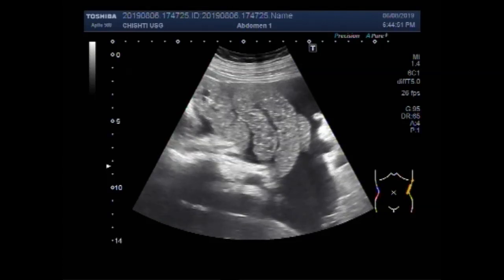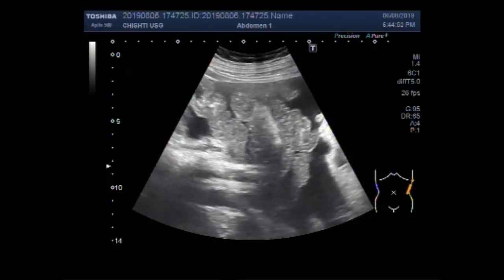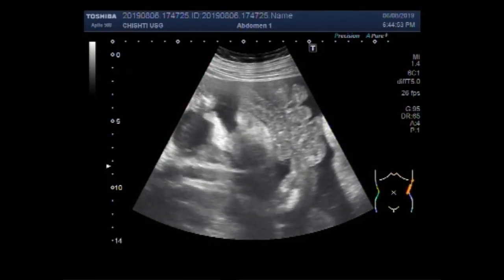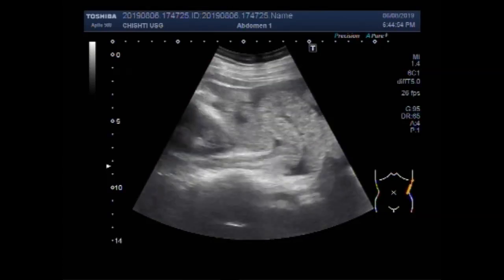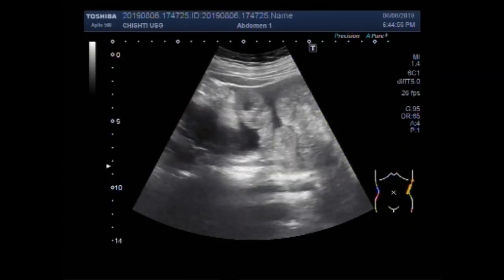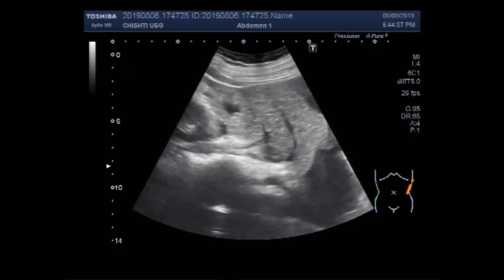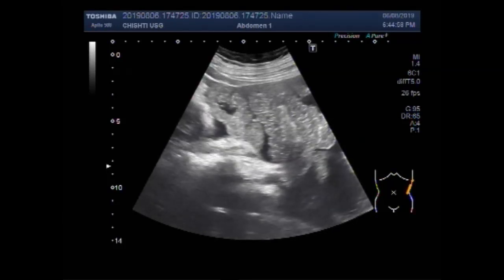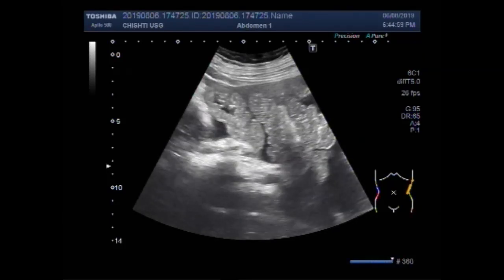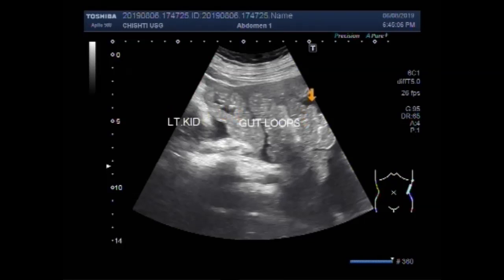Here also there is a large amount of thick free fluid and the gut loops are floating in the fluid present. This is the left kidney, these are the gut loops, and this is the free fluid.